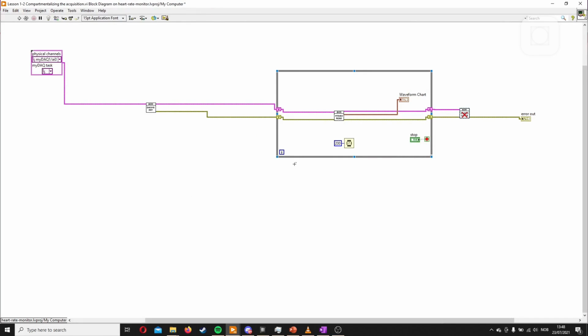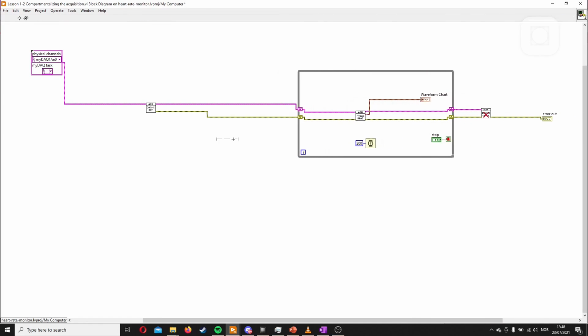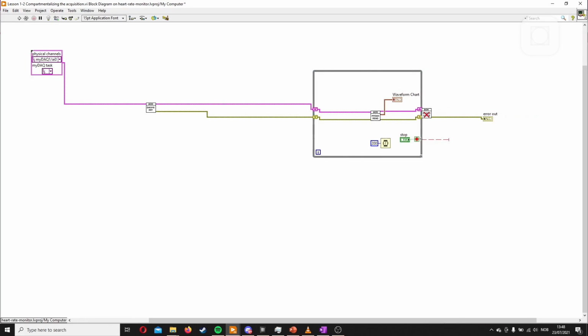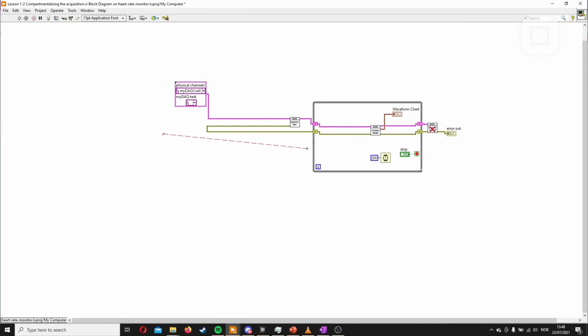And now for the cleaning. So what we want is to move everything here. A nice function is if you hold Control, you can push things further apart. But if you hold Control Alt, you can drag things closer to a certain extent. I can drag this one here, I can drag this one here, I can drag this one down, I can drag this one closer here. And now we can move this.